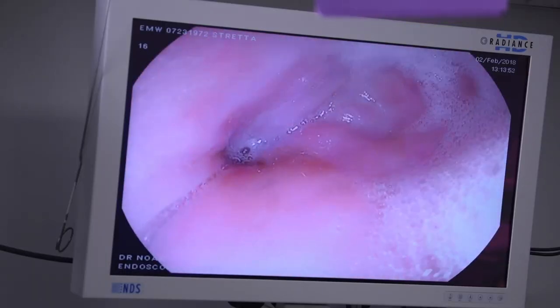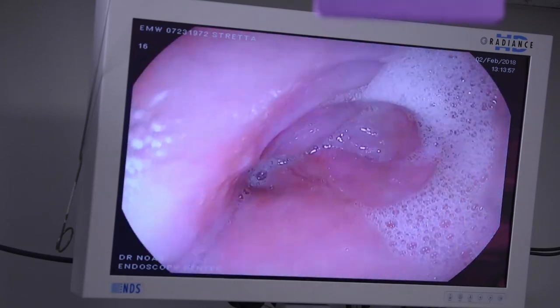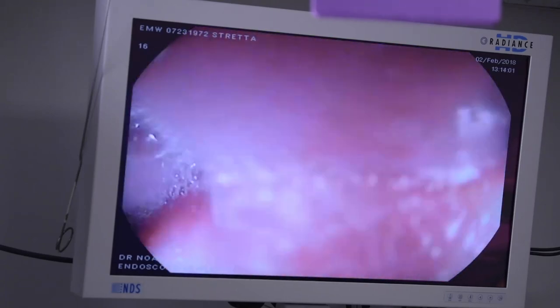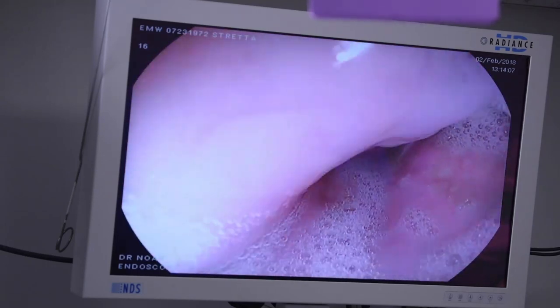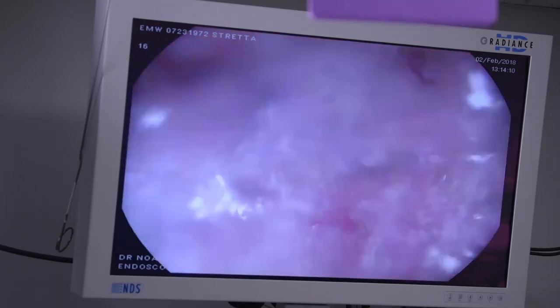As we look at the bottom of the esophagus, it is actually inflamed — we no longer can see the blood vessels, which tells us there is inflammation. We're moving down towards the junction between the stomach and the esophagus. We're going to measure this distance and we have to measure it three times to get three accurate measurements.